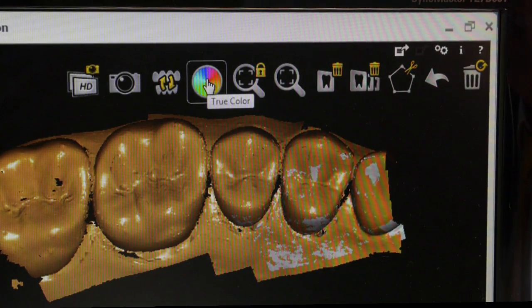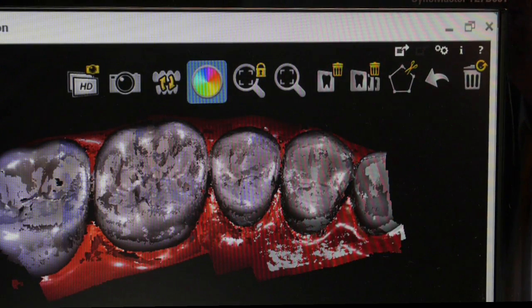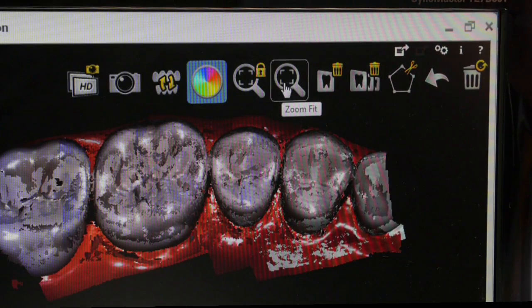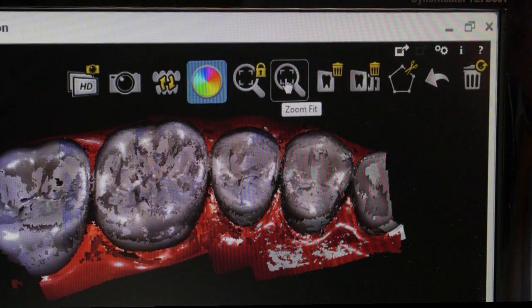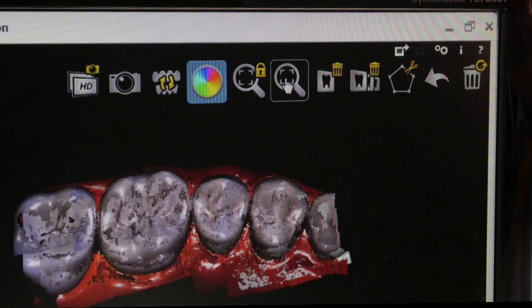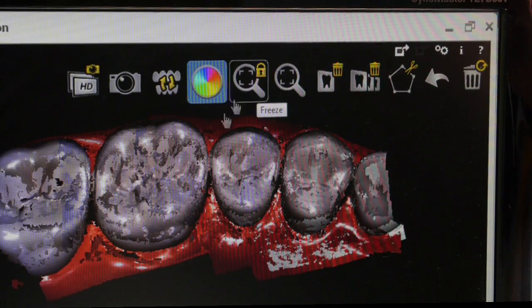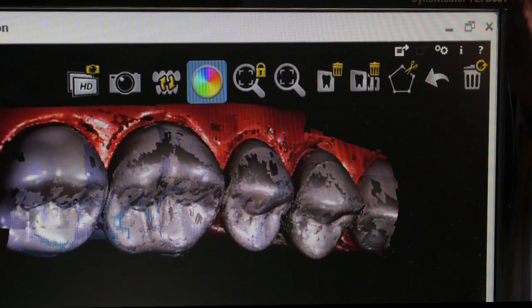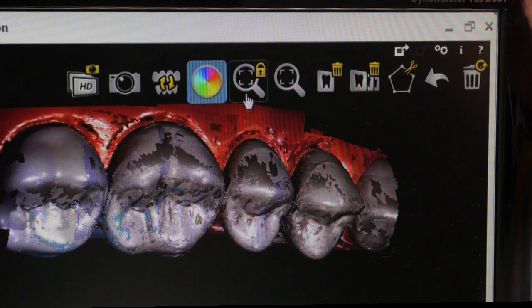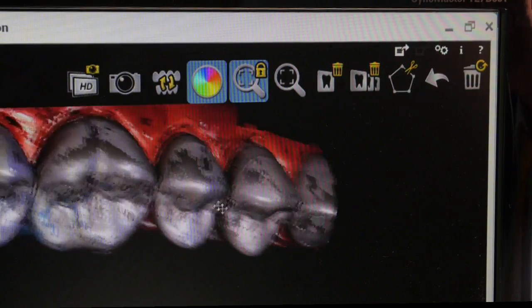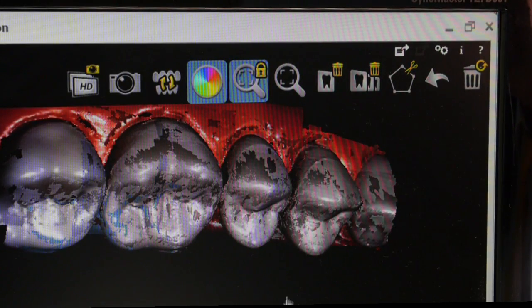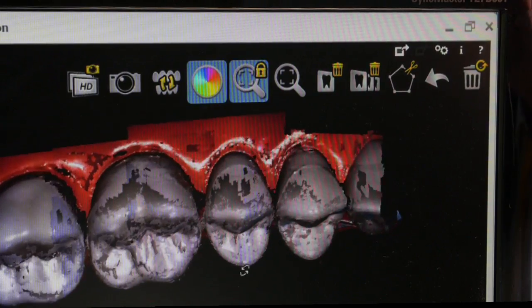Click back to resume into color. There are a couple of buttons here which allow you to zoom the image, although you can also do that using your scroll wheel on your mouse to blow up images and get them larger. This button freezes it, so if you've moved your arch to that position and you wanted to freeze that position, you can go in and scan without this image moving around the screen.